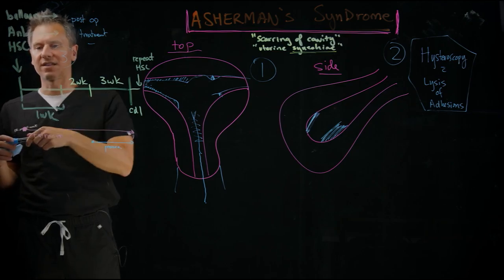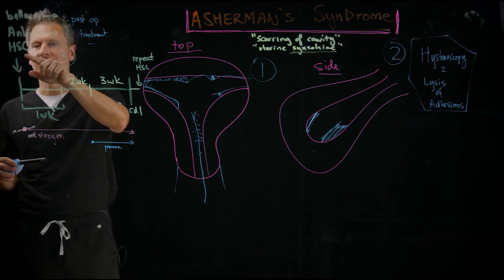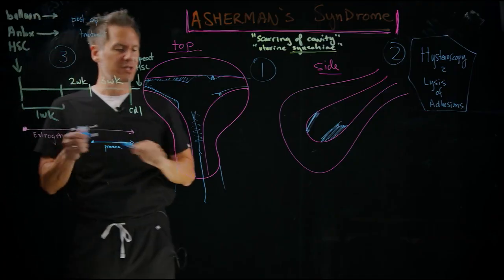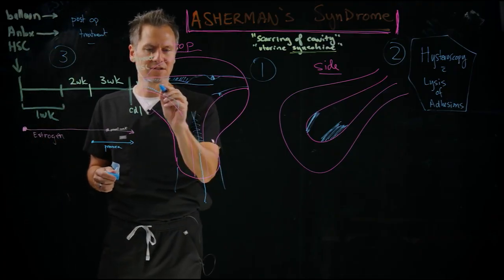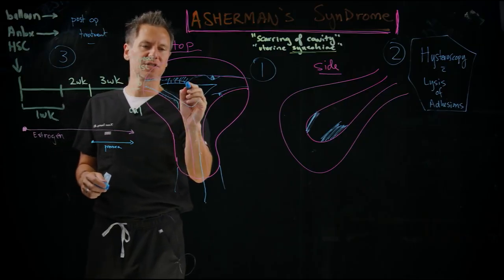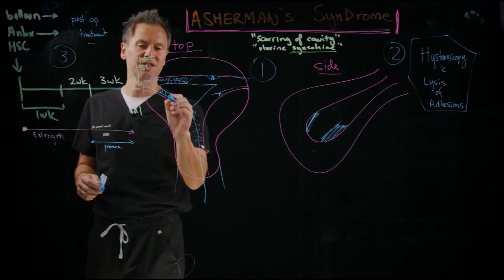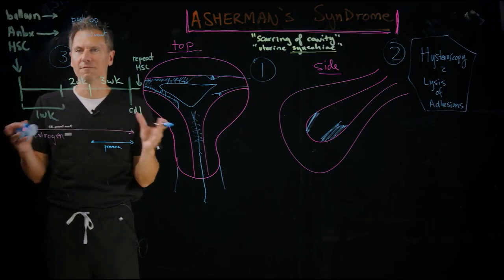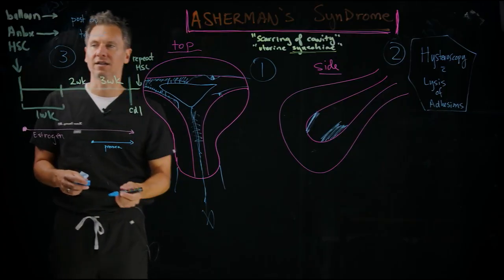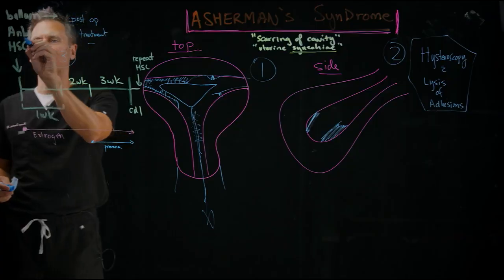The hysteroscopy, let's say, is on July 1st. You will put a balloon inside the uterine cavity that sits here like this, that prevents these raw surfaces from touching each other. So it's almost like a mold that sits in the uterine cavity with a catheter that hangs out of the vagina. Well, that's a foreign body, so we give antibiotics.